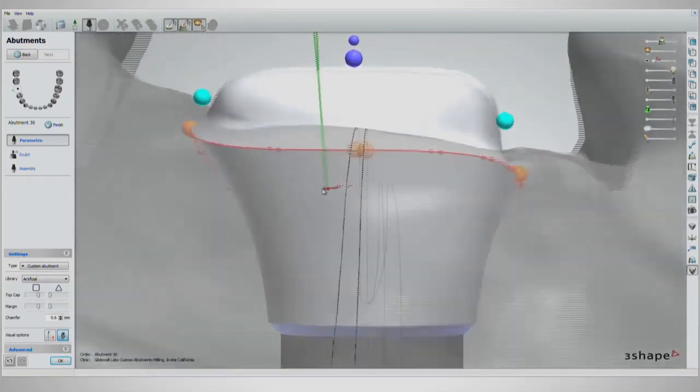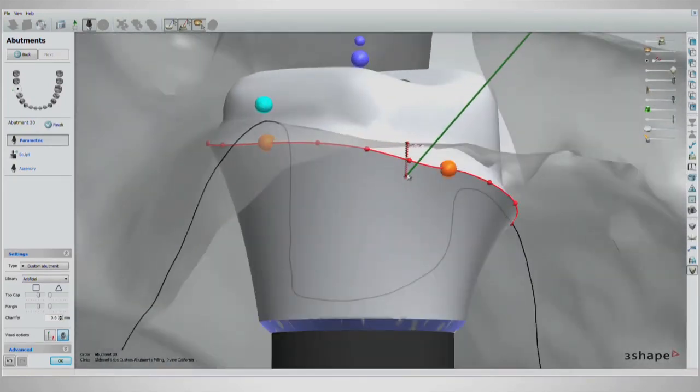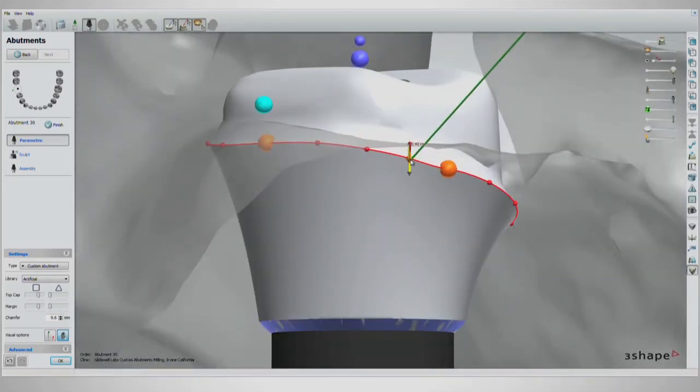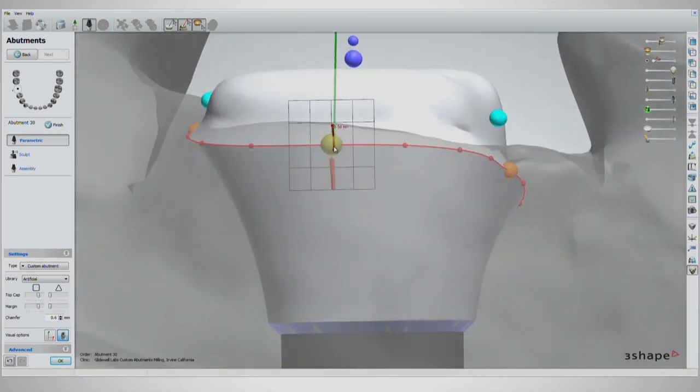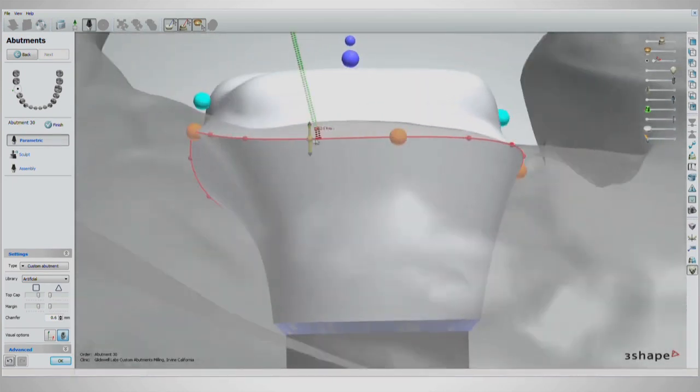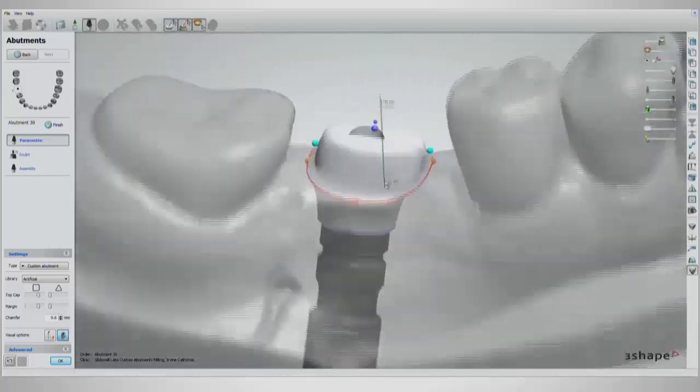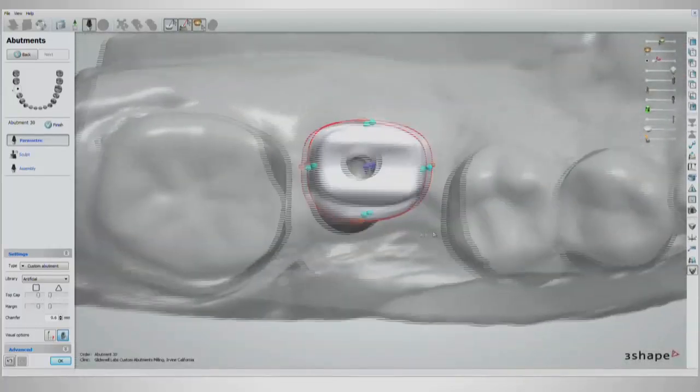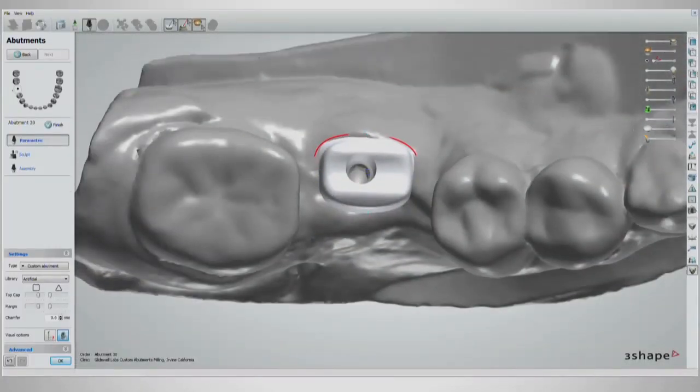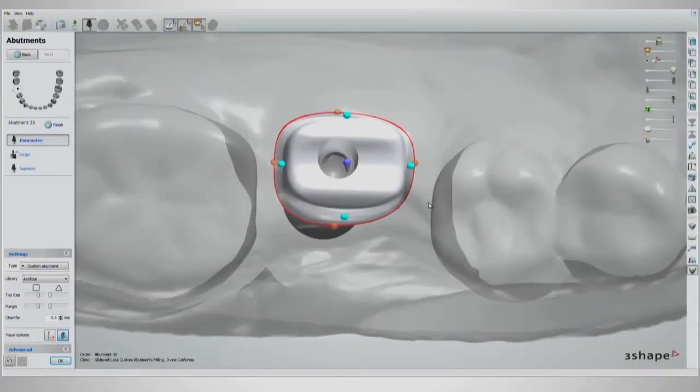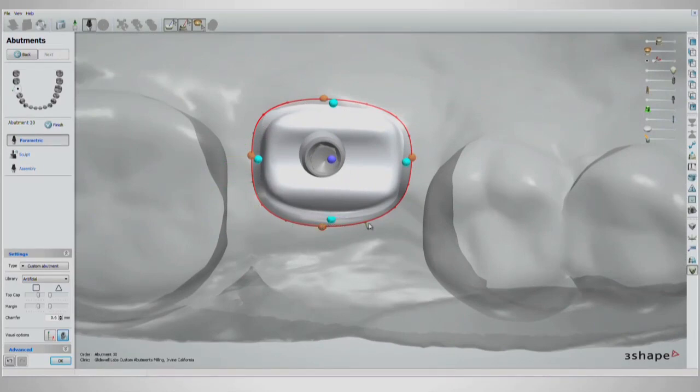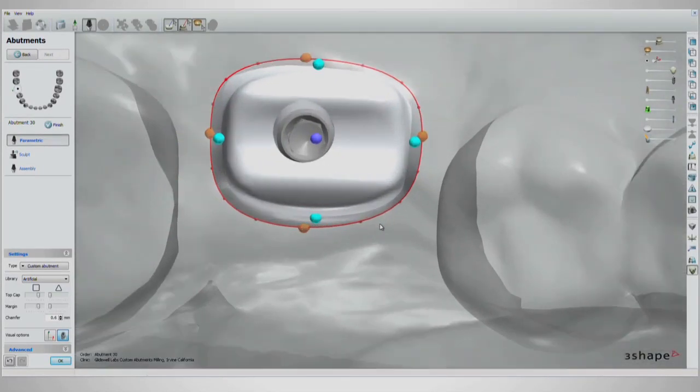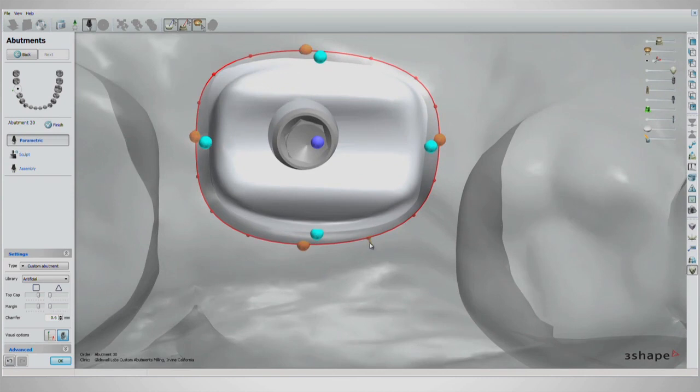Changes in the margin depth can be made incrementally by clicking and dragging the smaller red handles along the margin. If the shoulder is too narrow in some areas, go to the occlusal view and click and drag the small red handles as well as the orange handles outwards.